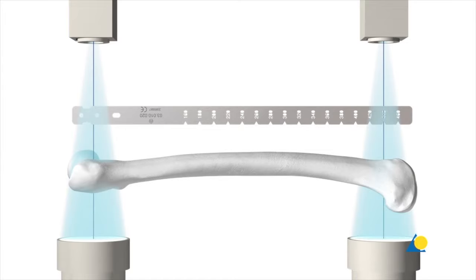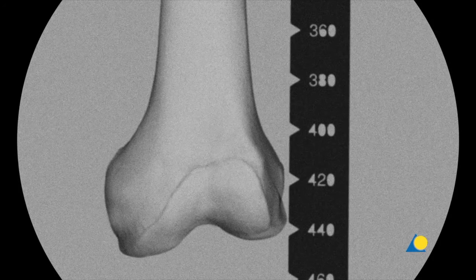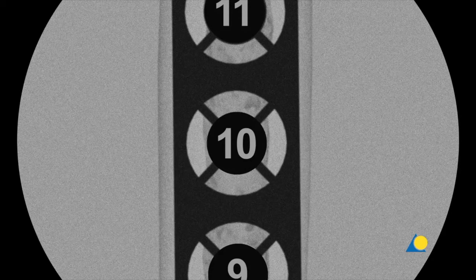The image intensifier is positioned to allow an AP and a lateral view of the femur. The tip of the radiographic ruler is placed level with the desired entry point, lateral to the tip of the greater trochanter. The image intensifier is then moved to the distal femur and the ruler is positioned in the region of the knee. The length of the nail is read from the ruler at the desired level for the tip of the nail, which usually corresponds to the top of the patella, or can just be proximal to the epiphyseal scar.